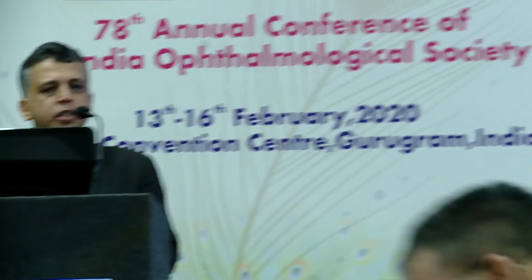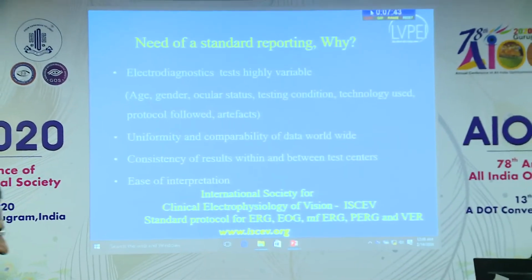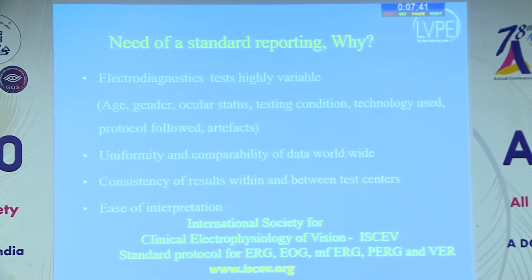Very good afternoon. I will quickly take you through the basic protocols for recording electroretinogram, electrooculogram, and visual evoked potential in the following slides.